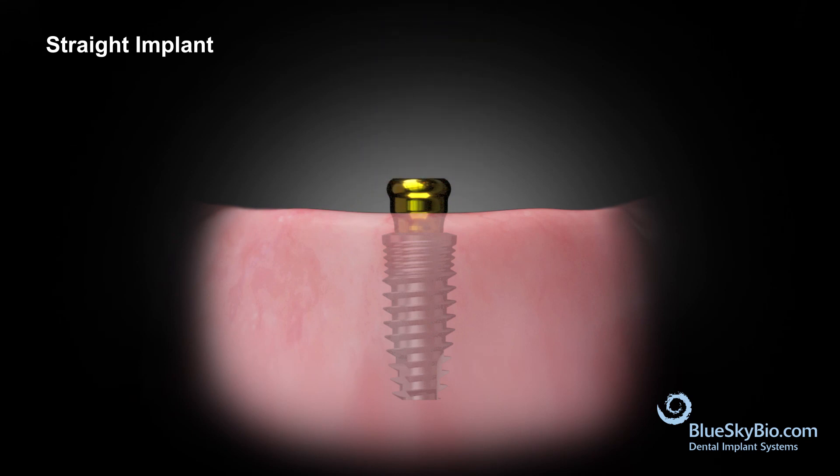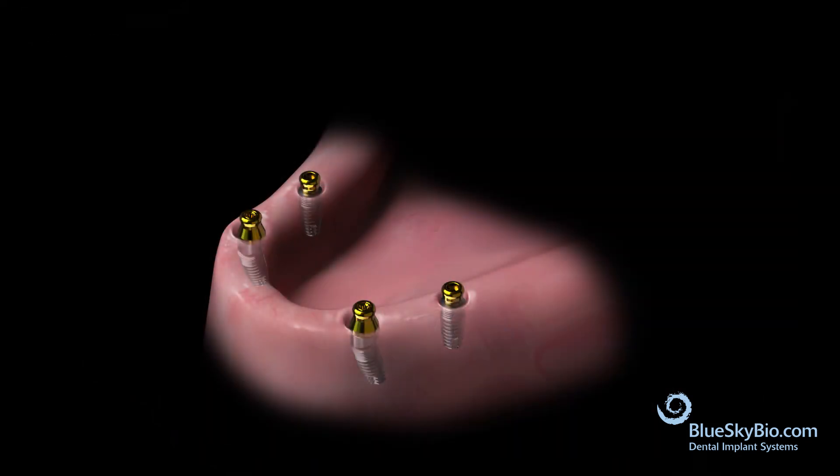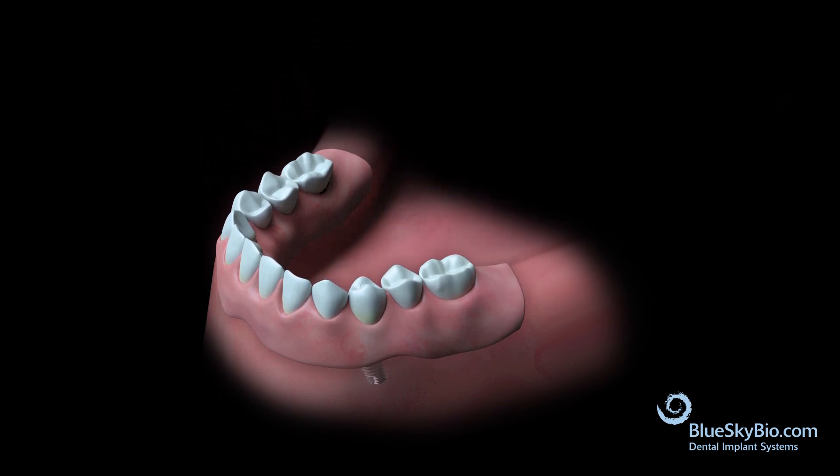Remove the block out rings. Place the denture into the mouth and verify proper retention.